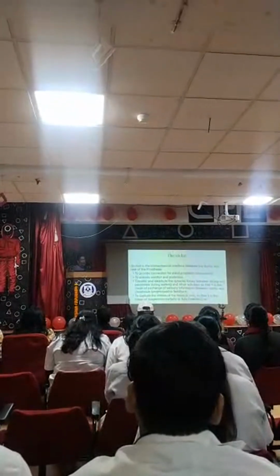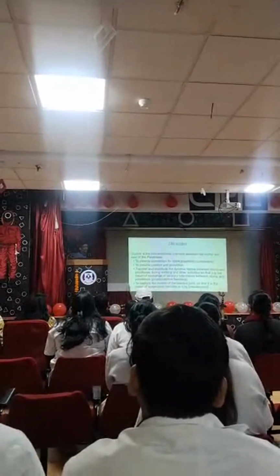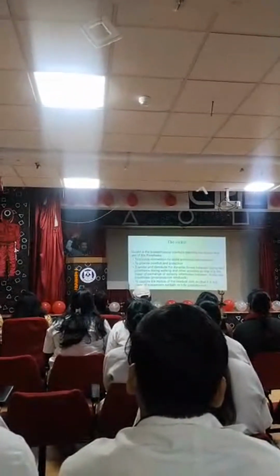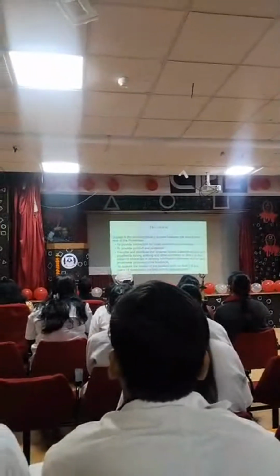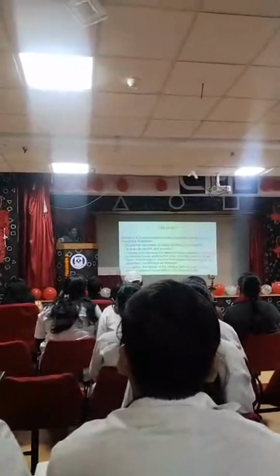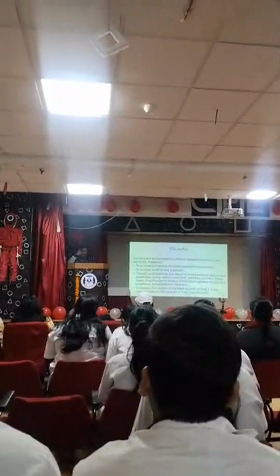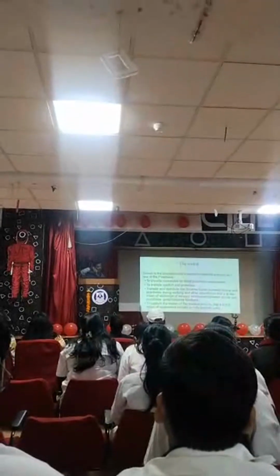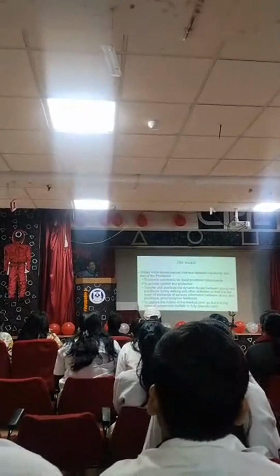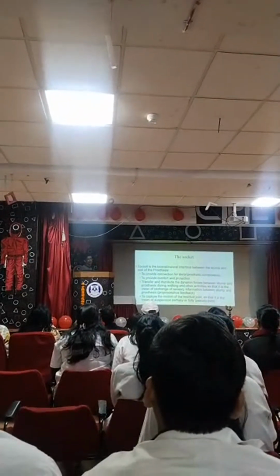So what other thing is the socket doing basically, apart from giving protection and comfort? The socket is also providing dynamic force transfer. So basically it transfers forces between the patient's body and the ground, that means with the ground. So when the patient is loading his prosthesis on the ground, this is the connection which will dissipate the forces which are coming from the ground or the forces which are coming from above. So these forces need to be dissipated if the patient has to feel comfortable. So this is the main function of the socket. The socket has to dissipate or redistribute the forces so that the patient feels comfortable.